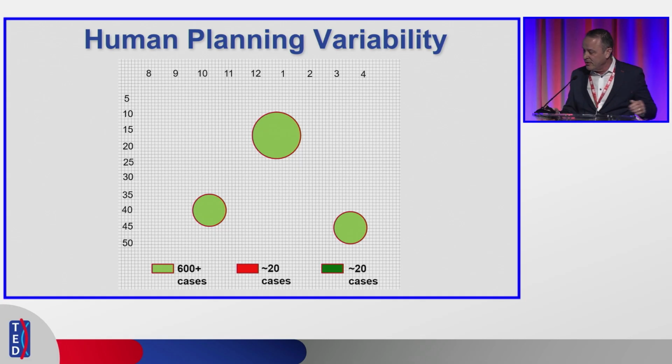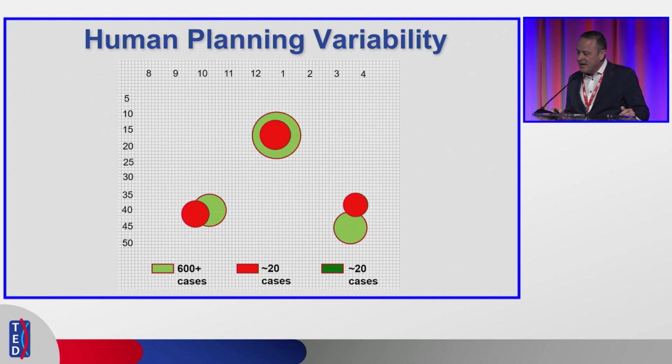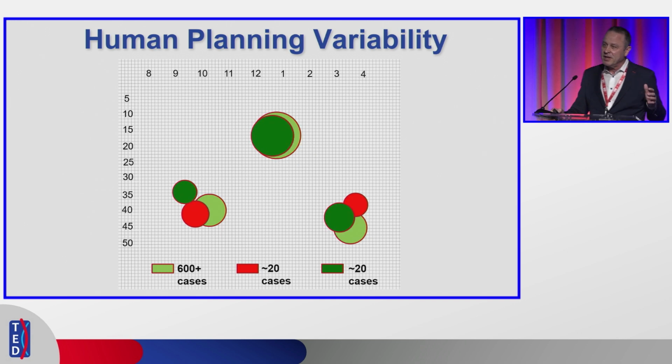So I asked my fellow in red to size this case. Mind you, I taught my fellow how to size these cases, and this was his plan. When we line up the SMA, he loses the left renal artery. Now I asked my chief resident to size it, and she sized it here. When we line up the SMA, she loses the right renal. Now how can that be? How can it be that two people I trained to size these cases could be so wrong?